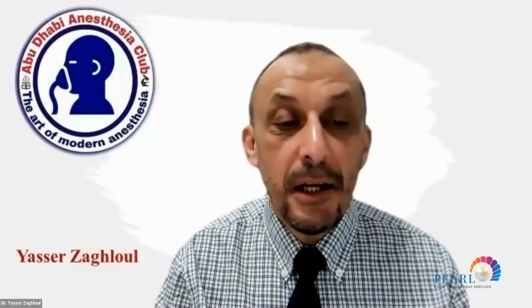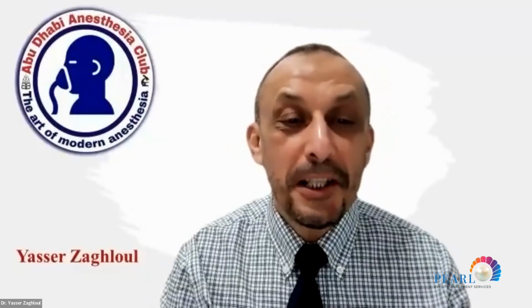Comment from Dr. Moder Shaker. He is asking, can we have a step-by-step protocol for the assessment of the airway? You mentioned a lot of ideas, but can we start from 1, 2, 3, 4? Yeah, because when you look at my presentation, I started from A to Z. You start from the floor of the mouth, then go to the hyoid bone and the thyroid cartilage to see the thyrohyoid membrane, and then go down to see the thyroid cartilage and the larynx.